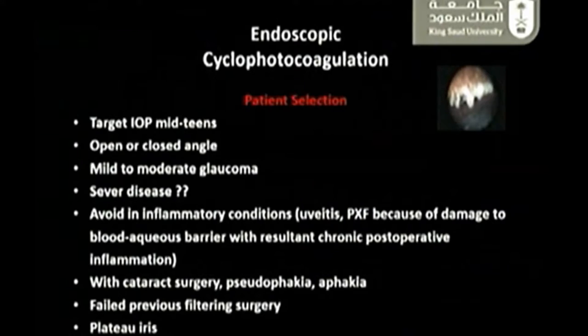You should avoid it in inflammatory conditions such as uveitis or in patients with very significant pseudoexfoliation deposition on the ciliary body, because you need to actually increase the energy more and more, and therefore you will induce what? Damage to the blood aqueous barrier and chronic inflammation after that. You can do it with cataract surgery, in pseudophakia, or in patients who are aphakic.